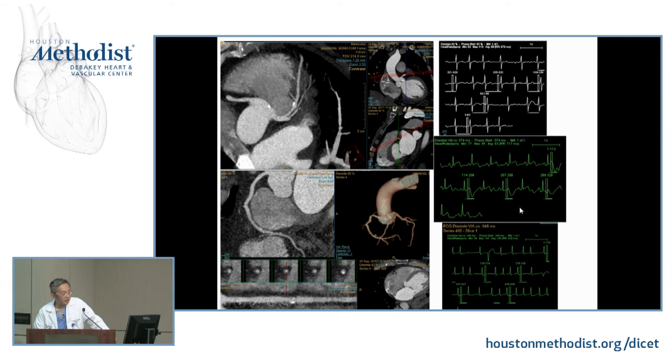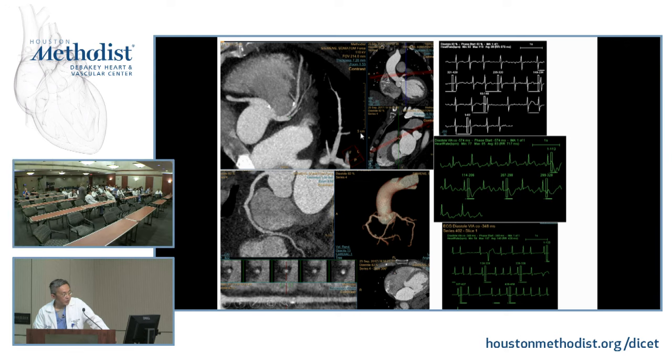There are 3 EKGs here. Which of these 3 EKGs does this patient have? Okay, so I'll give you this: this is AFib, right? This is sinus, and this is AFib also.